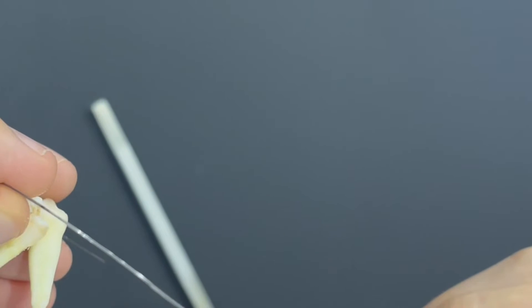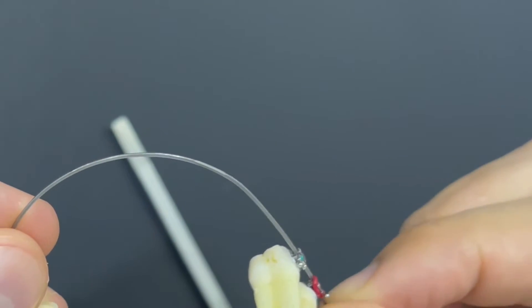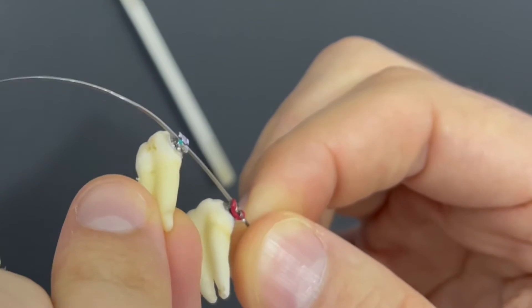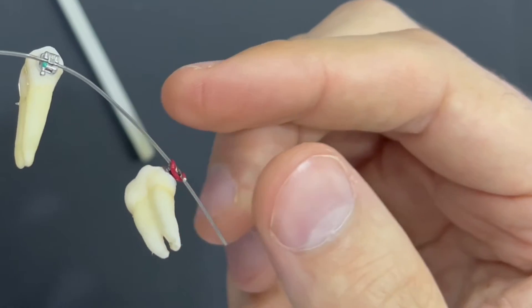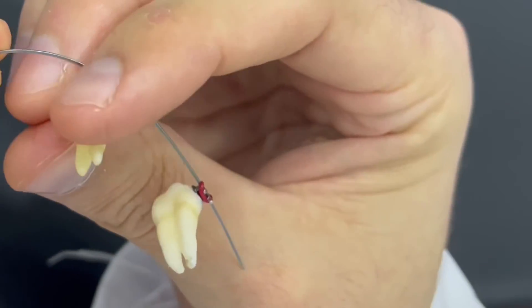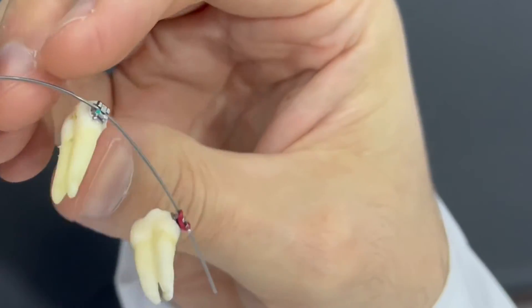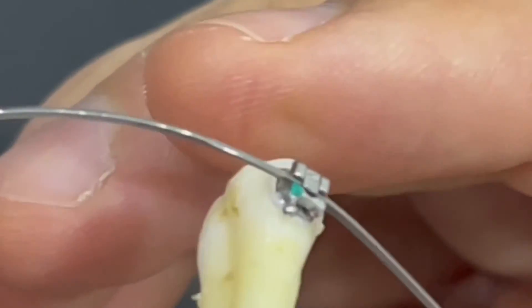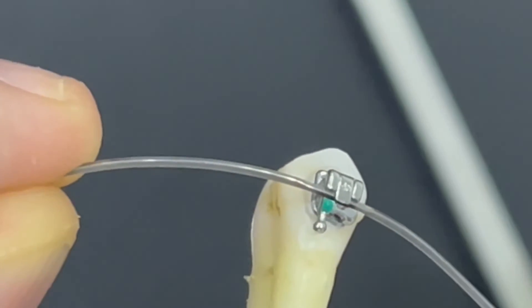We see here the different shaping of the wire at this location. When we pass the tooth over that place, we see the inclination has already changed. We make the root more lingual or palatal and the crown more labial, so we have increased the torque on that tooth.